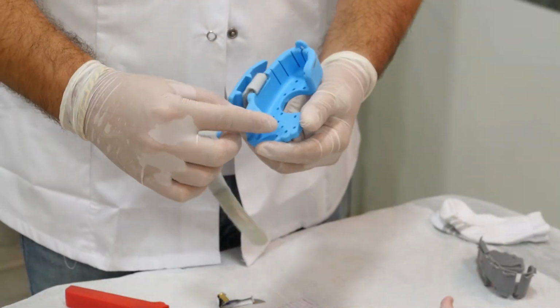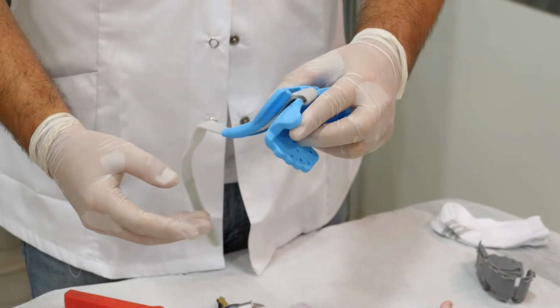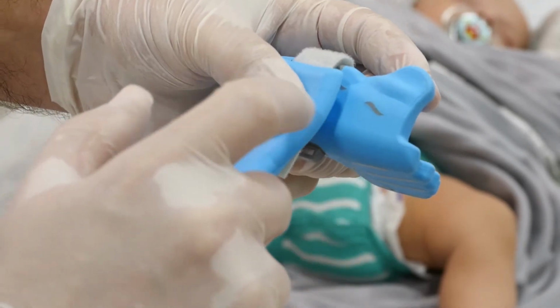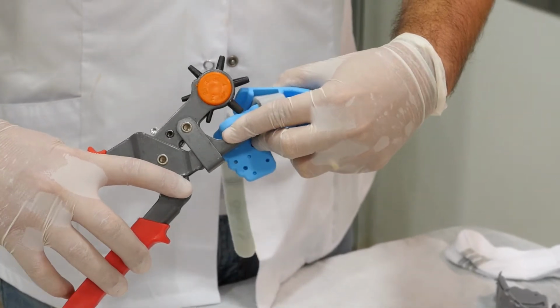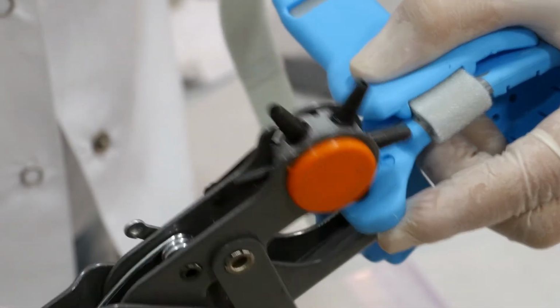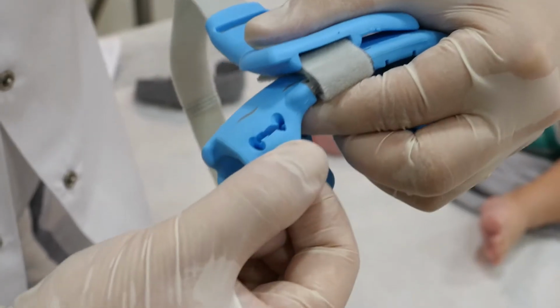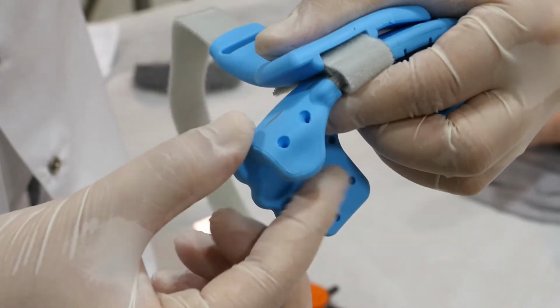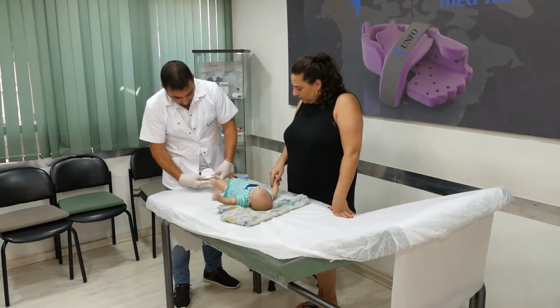Another possible adjustment would be releasing pressure from the toe. If the baby's toe is inclined upwards, the pressure on it must be released by making 2 holes in the soft area, which is on top of the rigid area in the toe fastener, and making a cut to connect the holes. Before the Unfo brace is installed on the baby's foot, a sock must be worn.